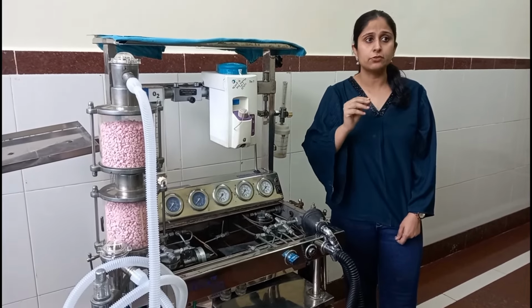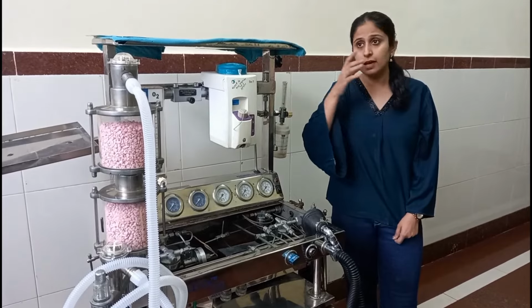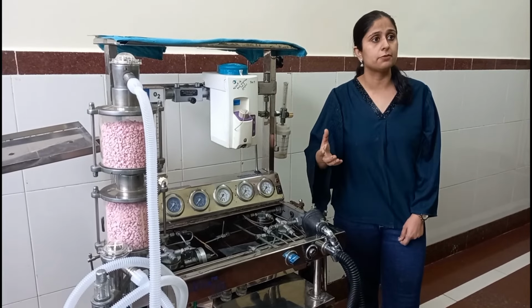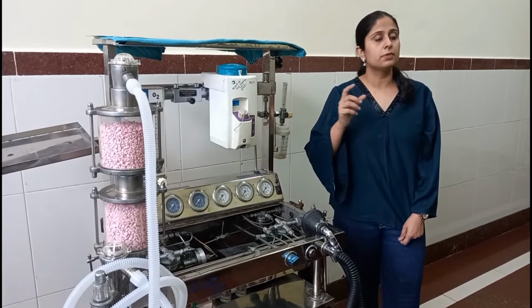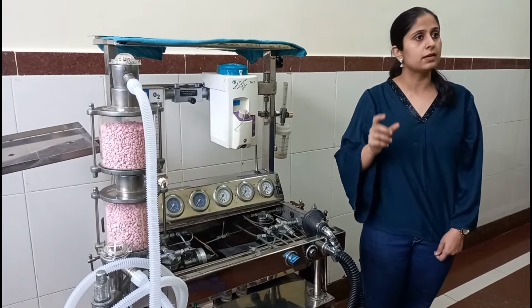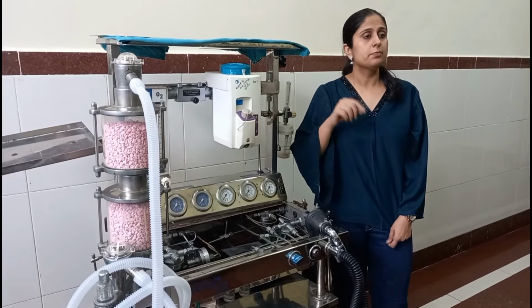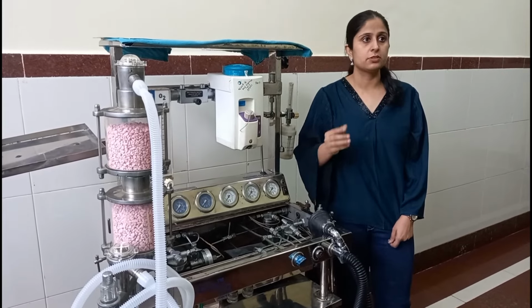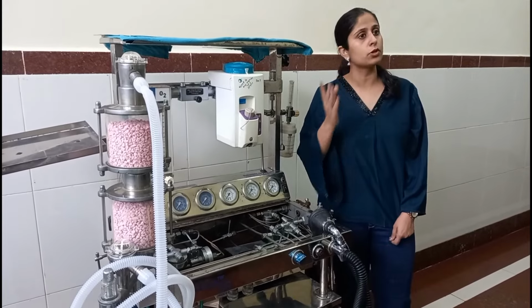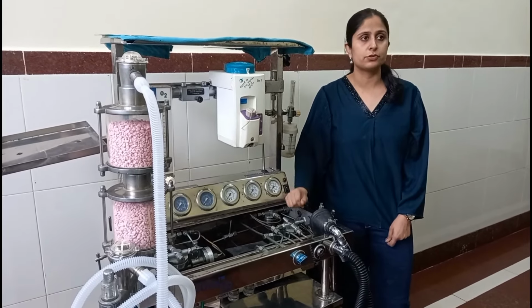This oxygen and nitrous oxide, when they come from that high pressure system to the level of the machine, have to be reduced by a reducing valve. In the intermediate pressure system we have the cylinders and the pipelines: cylinders have a psig of 45 to 50 and the pipelines have 40 to 50 psig. So from 2000 down to 40 to 50 there are reducing valves which will reduce it. And the last is the low pressure system.